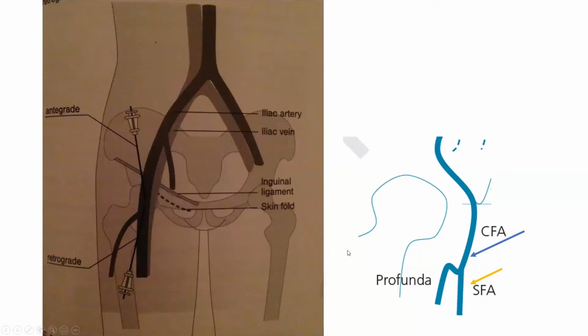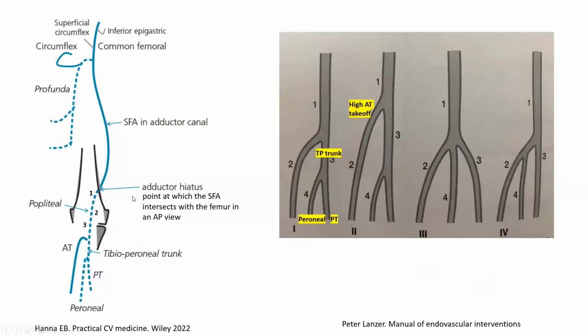Okay. And actually, I looked at series of antegrade femoral access. In close to 65 to 70% of the time, even in series, not just myself, operators use SFA stick. The problem is closure here, and you oftentimes need to use a closure device. I used to use Minx closure under ultrasound guidance to close those, but you need to be ready to do up and over or transradial balloon occlusion if your closure fails.